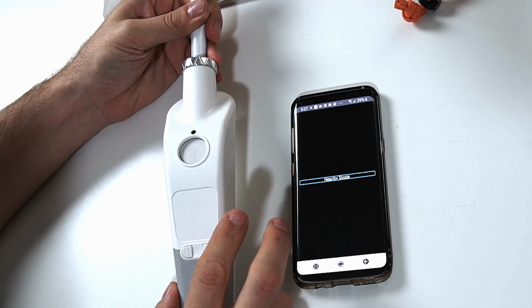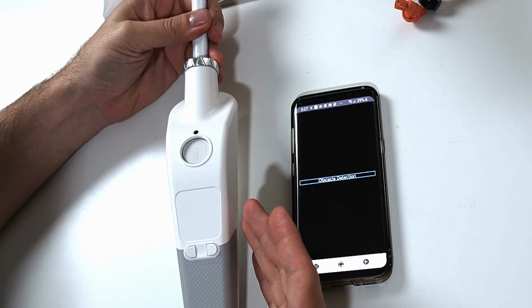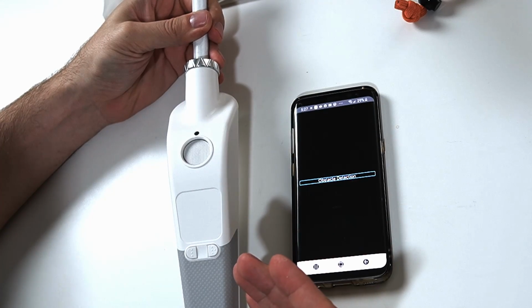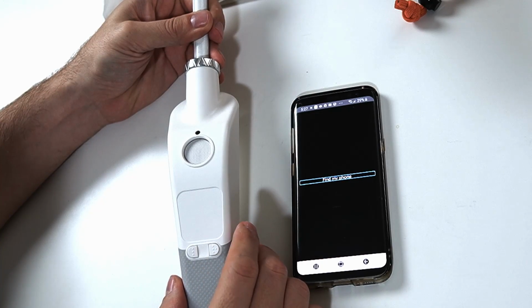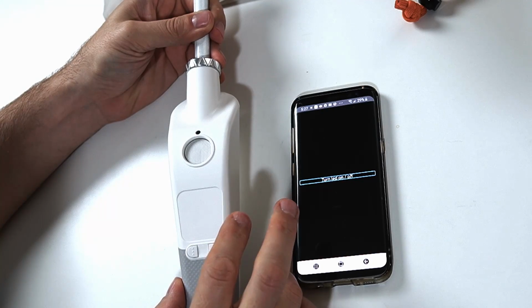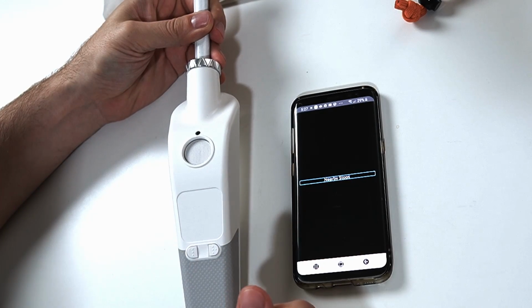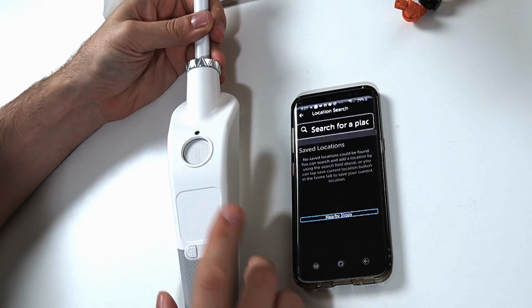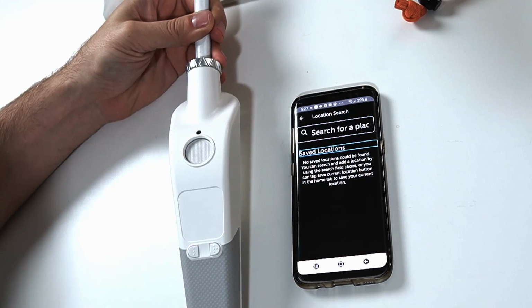Nearby stops. Obstacle detection. This is one thing I've noticed: the voice tends to break up a little bit. That could possibly just be my unit here, but it does that quite often. Find my phone. Sometimes it's clear like that, and sometimes it breaks up. Turn LED on. Navigation. Nearby stops. So you hear that breaking up just a little bit. And then if we want to get out of the menu, we just swipe down. Menu closed. Locations. And we're back to obstacle detection.